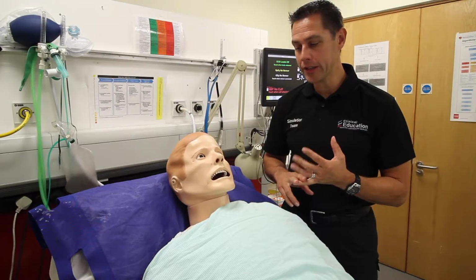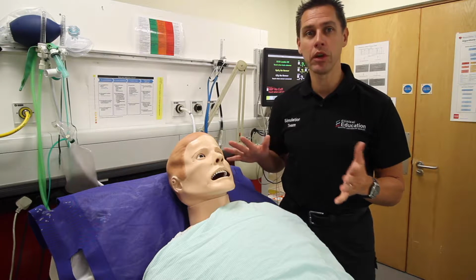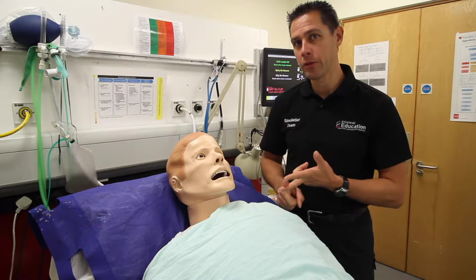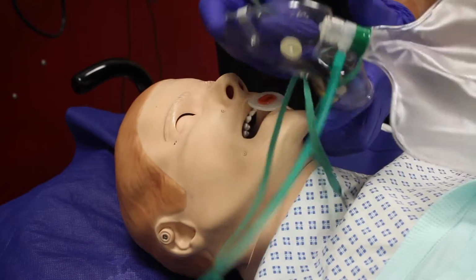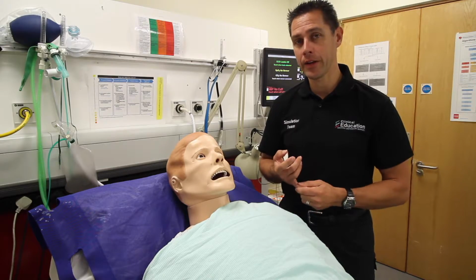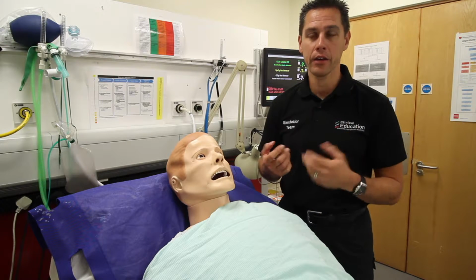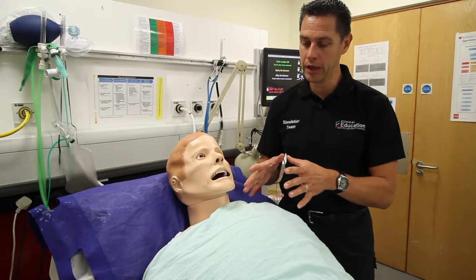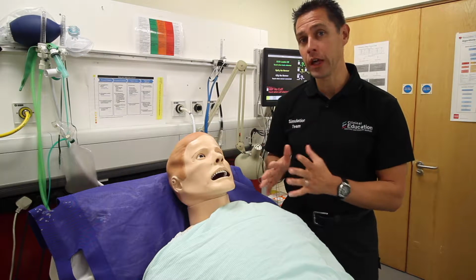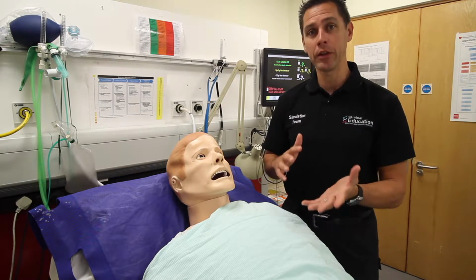So his airway, essentially he's an anaesthetic mannequin originally, so his airway, you can do everything you would like to do with an airway really. So you can intubate him, you can put laryngeal masks in, you can ventilate him via a bag valve mask, you can put oropharyngeal airways in, nasopharyngeal airways in, and if we have to, we can do front of the neck airway management as well. So his airway is fully functional, and we can make it more difficult to intubate or less difficult to intubate depending on the scenario that we're doing.